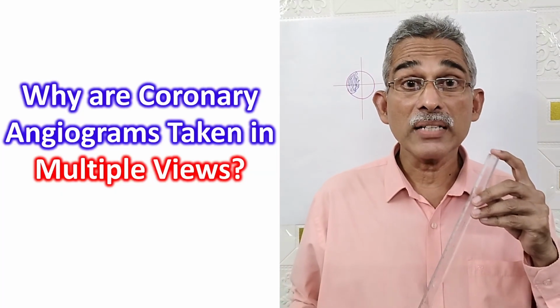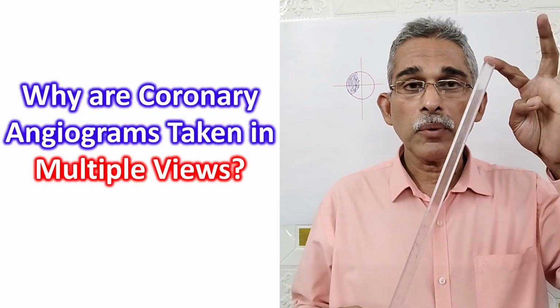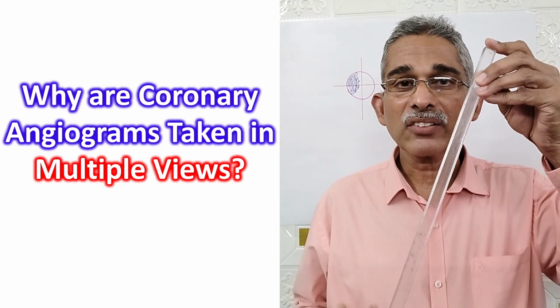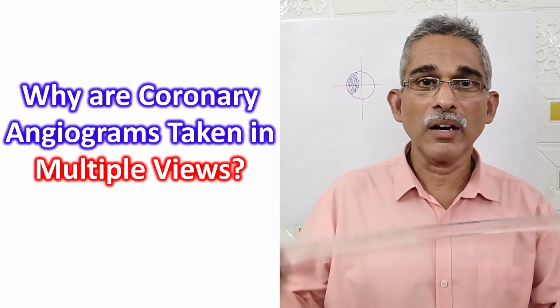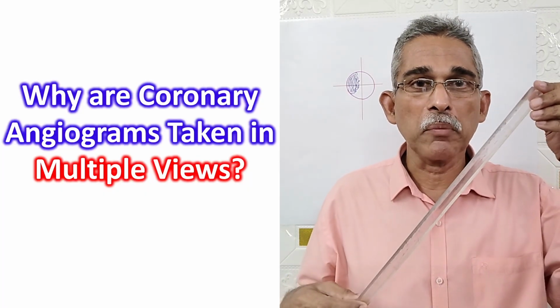Now there is an advanced form of coronary angiography known as three-dimensional rotational angiography. Suppose this is a gantry. Here you have the image intensifier. Here you have the X-ray tube. During injection, usually you keep this in one position, either this way or this way, whichever position. It could be tilted cranially, caudally, all those angulations may be made.